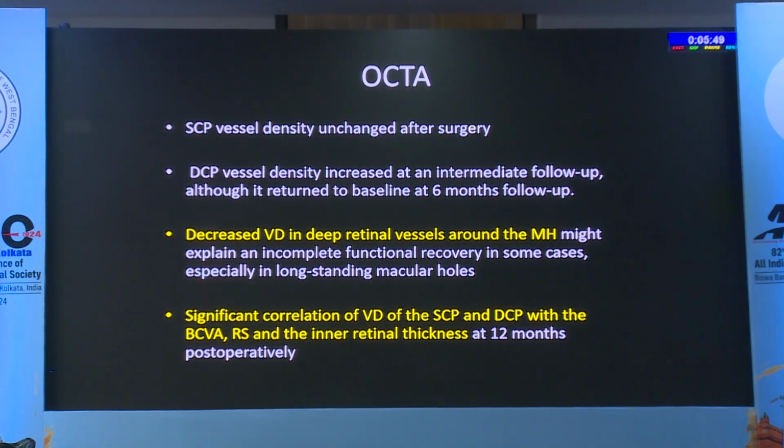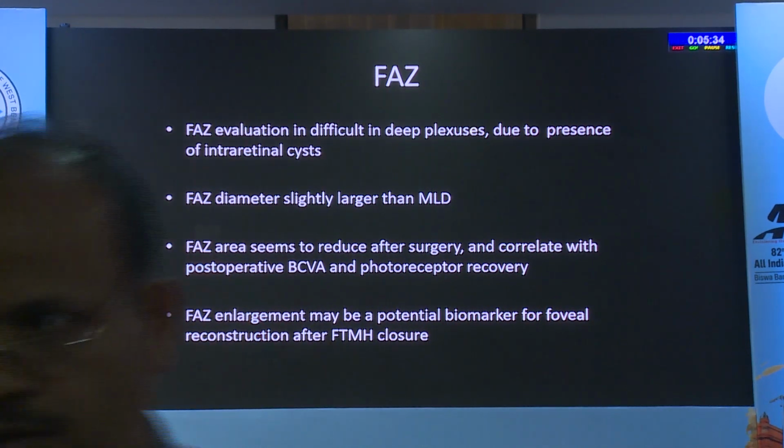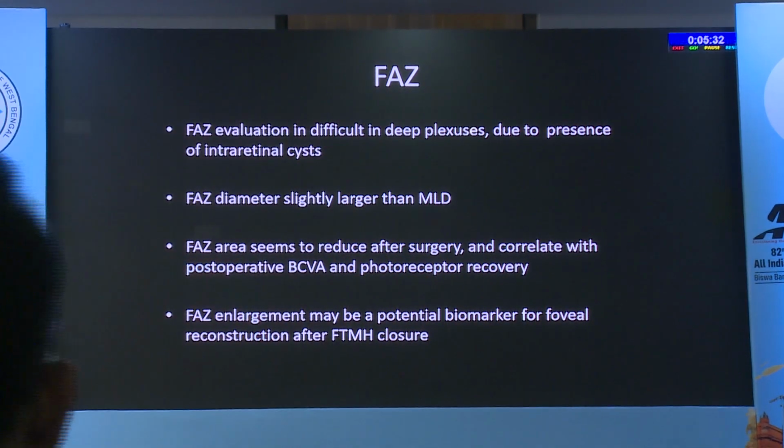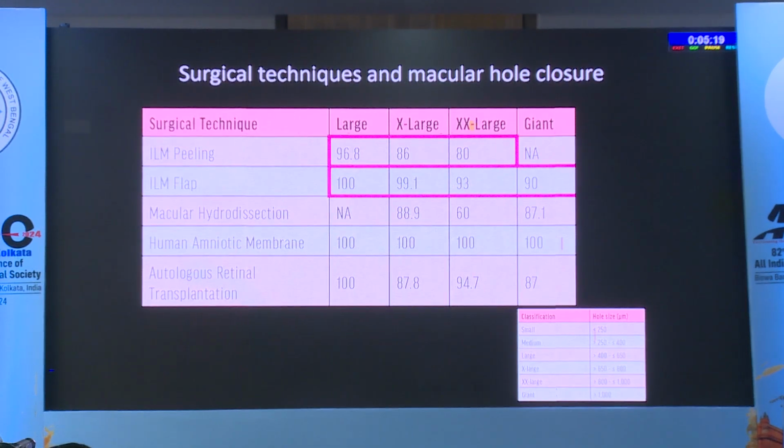OCTA, definitely, studies have shown that there is a significant correlation between vessel density of the superficial capillary plexus and the deep capillary plexus with respect to the visual acuity as well as the retinal sensitivity at 1 year. FAZ enlargement may be a potential biomarker for foveal reconstruction after full thickness macular hole, but sometimes the FAZ evaluation may be difficult, especially because of the presence of the intraretinal cyst. But FAZ also can give a clue to the prognostic aspect of the closure.